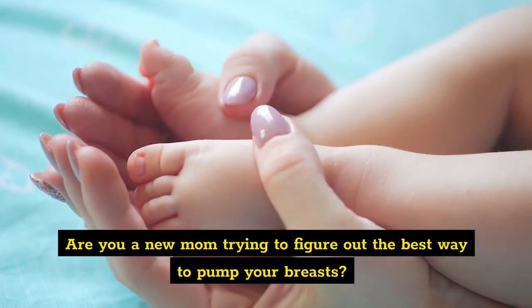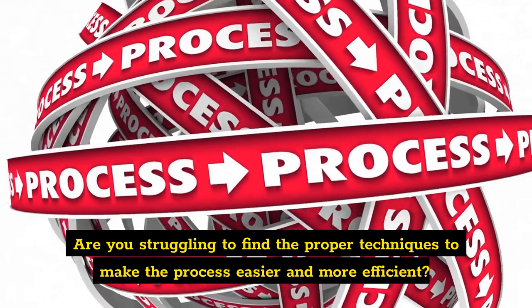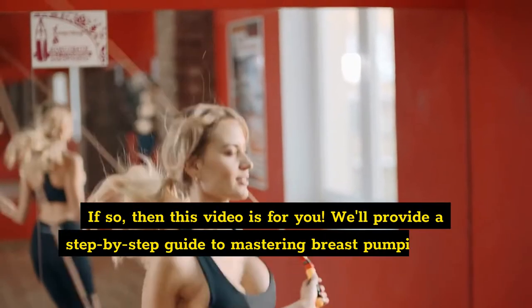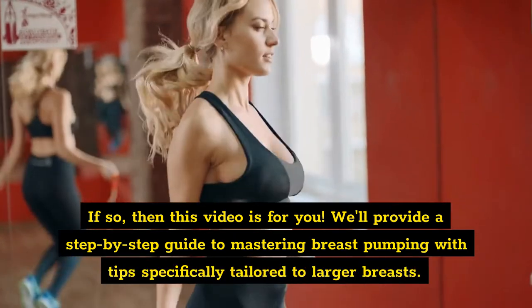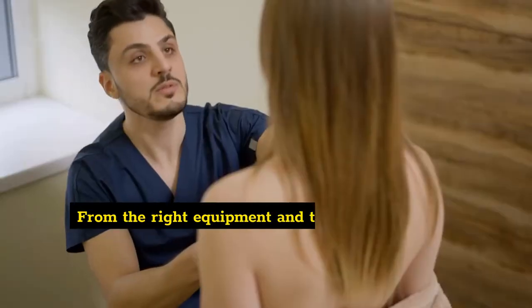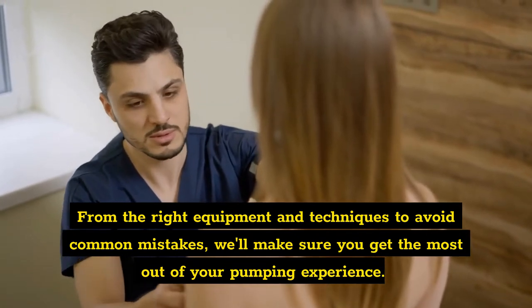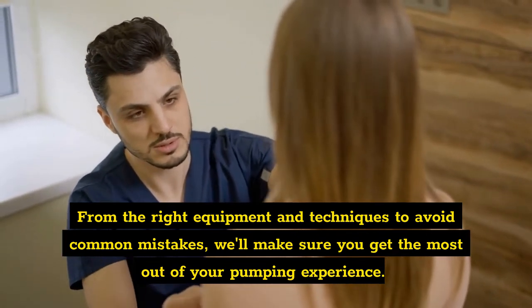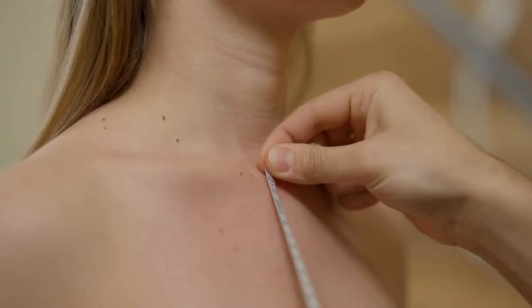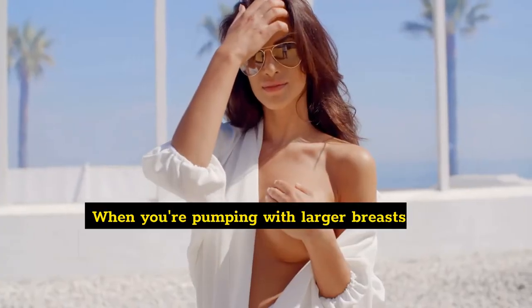Are you a new mom trying to figure out the best way to pump your breasts? Are you struggling to find the proper techniques to make the process easier and more efficient? If so, then this video is for you. We'll provide a step-by-step guide to mastering breast pumping with tips specifically tailored to larger breasts — from the right equipment and techniques to avoid common mistakes — we'll make sure you get the most out of your pumping experience. So if you're ready to start, let's get into mastering breast pumping: tips for larger breasts.